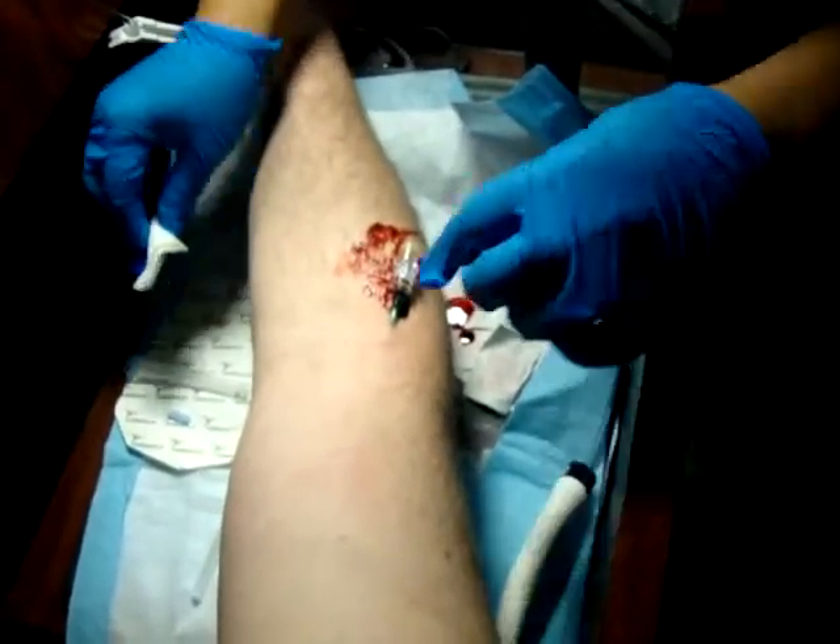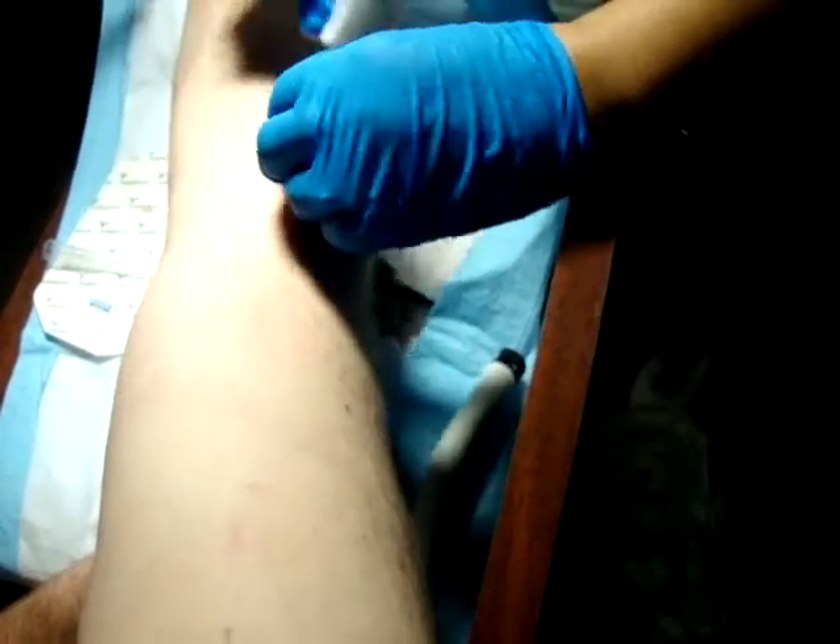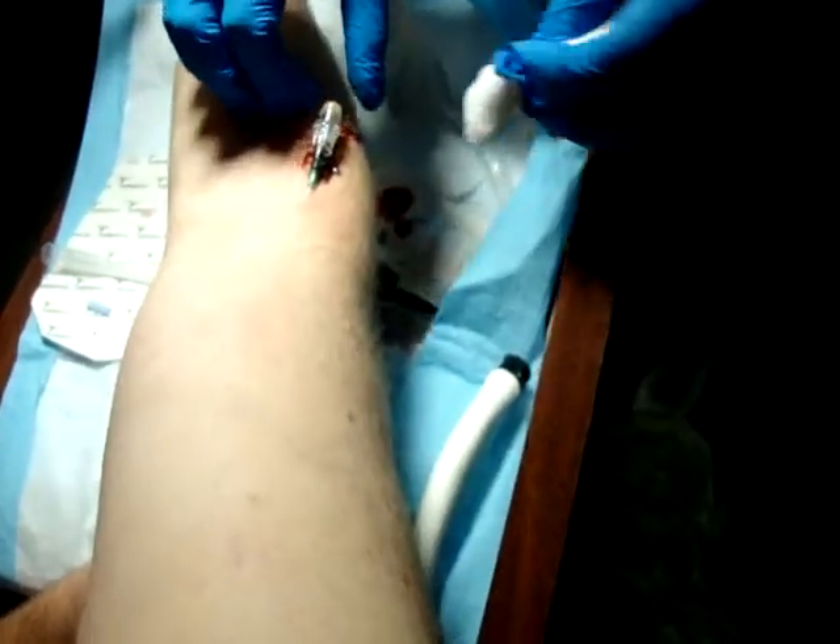You can let go. Hold on to this green part right here and twist the saline lock in. There you go. Maintain positive control, cleaning all the blood off, making sure they don't look like a crime scene.